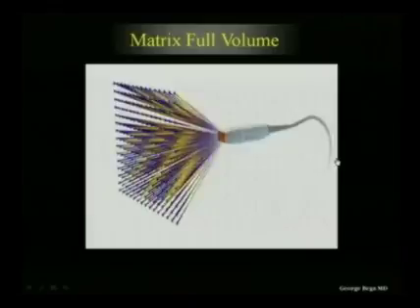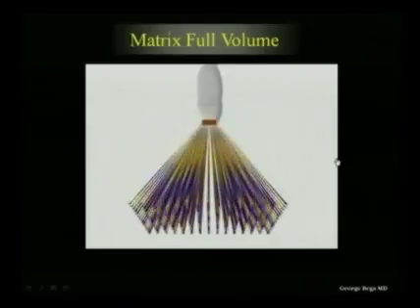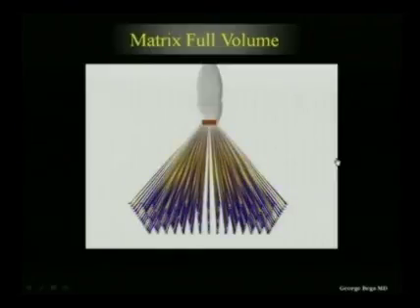As I mentioned before, for the first time we can have a very fast frame rate. We can have a block of tissue, and we can scan in real time with this large amount of volume. Typically, the volumes are faster when we have a smaller aperture, and then we can really have 30 frames per second. But this is one of the weaknesses right now of matrix arrays: the aperture is still narrow. In order to go fast, we would have to keep a narrow aperture up to now. And as we know, in obstetrical scanning, ideally we would prefer wider apertures.